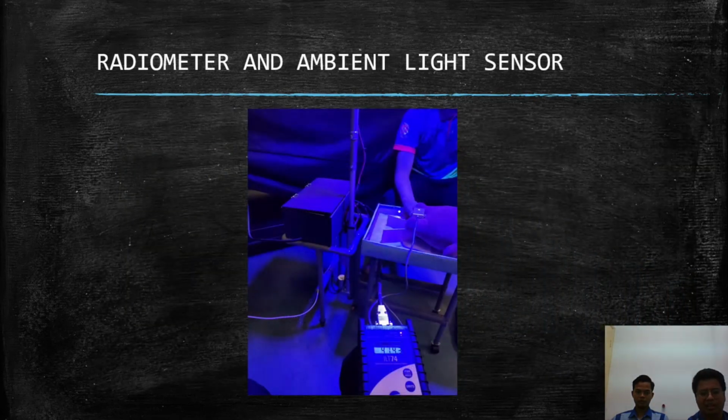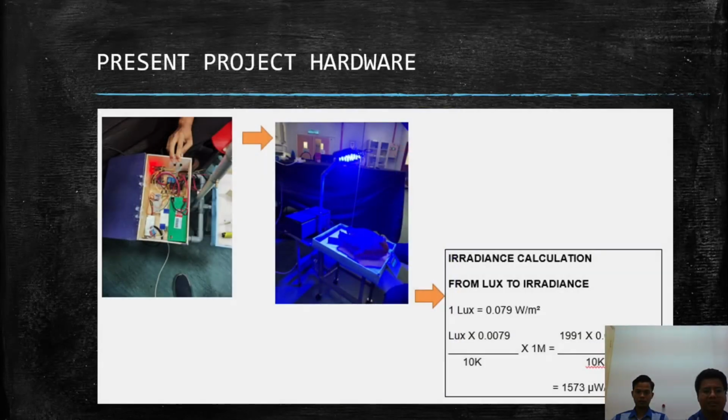So this is our picture for testing the radiometer and ambient sensor for comparison. Okay, this is our flow. This is the project. The second picture is when we turn it on.